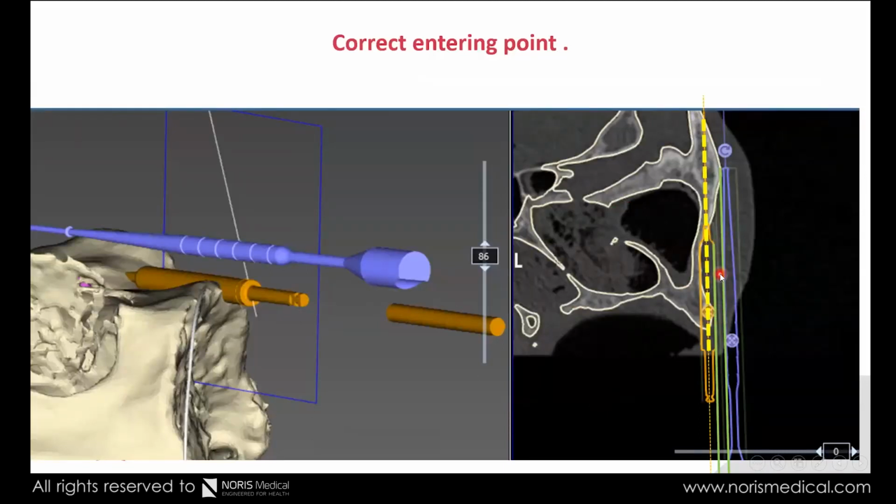Now, I'm not saying this is easy. It's not. And we need to make sure that we are measuring at the right position and so on. But it is a measuring tool that, once we practice, could help us understand what to do. It is not obvious like the orbital angle checking, because that can be done outside of the face just looking. It is more difficult doing it this way, but it is a tool that once you practice actually gives you results.